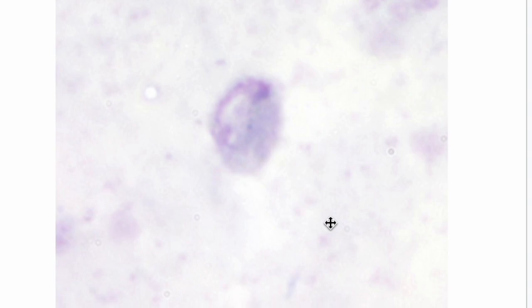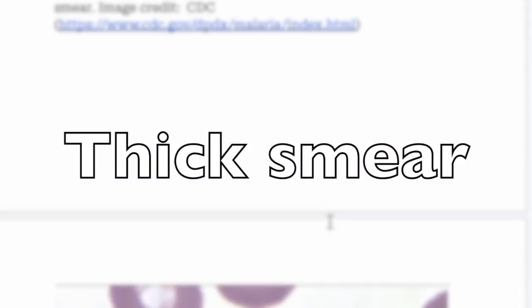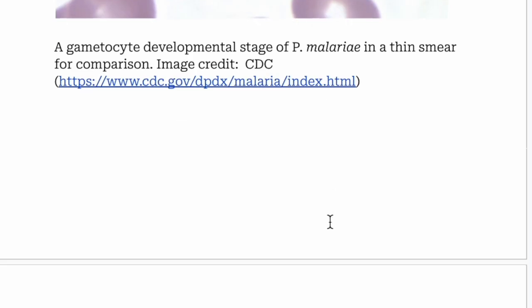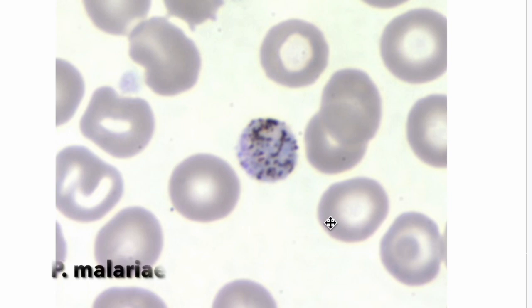So here's a gametocyte of P. malariae. You can see it's not banana shaped, it's quite round. And this one is in a thick smear. But if you have a look at the thin smear, you can really see that it takes up a large part of the red blood cell. And here's another one with a bit more of a lighter background, so it may appear like that. And here it's in a thin smear once again.